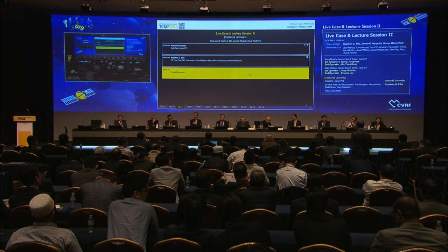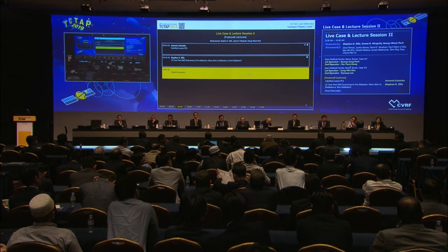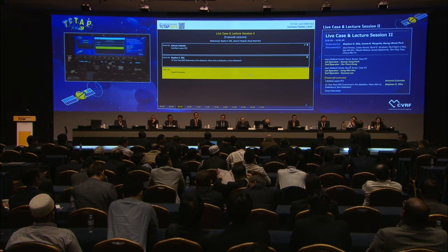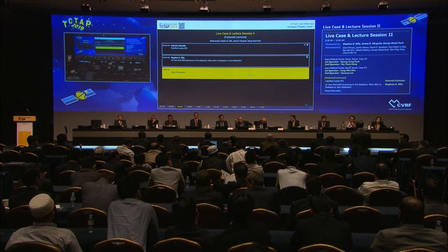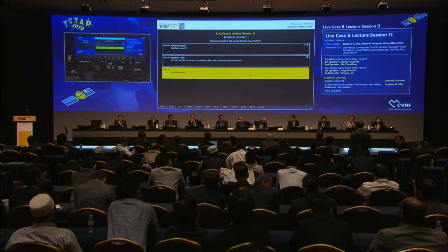And I'm eager to try also orbital atherectomy. I think orbital atherectomy is interesting, and the advantage of orbital atherectomy versus rotablation is that you can do the procedure on the way back. And if you have a very angulated vessel, doing the procedure on the way back may be more advantageous than doing on the way in, because you go for the wire biased in the opposite direction, not towards where you perforate. So I think the perforation rate may be very low if you do it on the way back. The way back you cannot do with rotablation, because it's not made for that.